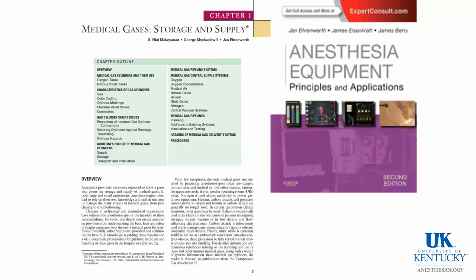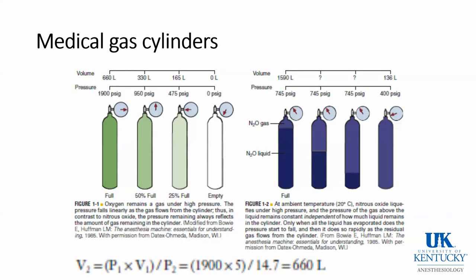This chapter in anesthesia equipment is an excellent reference source, and this slide serves to show how the pressure in an oxygen tank is proportional to the volume in the tank, and how this is not the case with nitrous oxide because there's a liquid in the nitrous oxide cylinder. This is Boyle's law. Nitrous oxide follows Boyle's law, but only after all the liquid has evaporated.